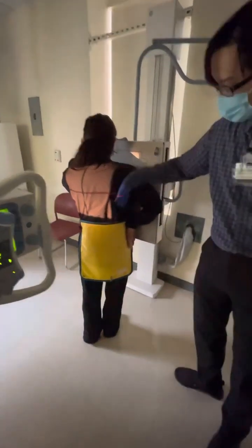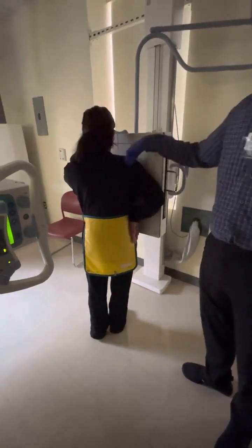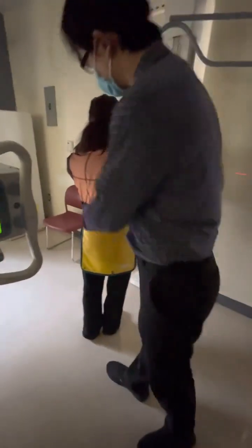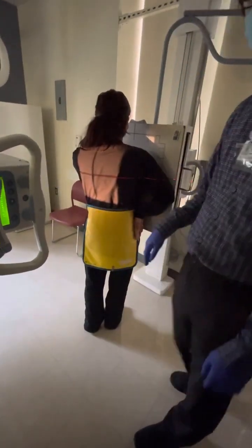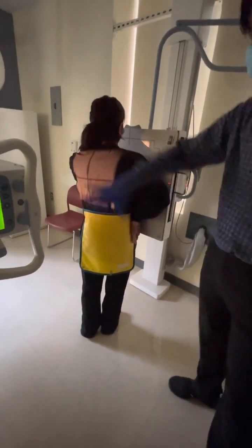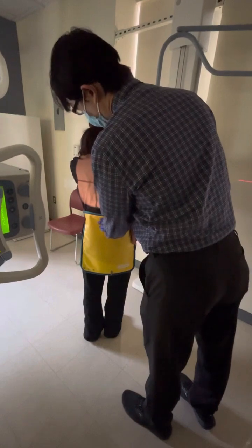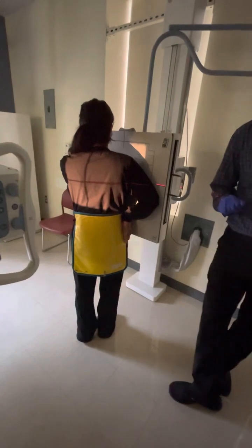Notice, what do I have on the right side now? No light. I have shadow here. So this is focused entirely on the left side, right? I do not have the right side on this picture anymore. So I can even collimate it just slightly. That's the difference between unilateral versus bilateral. Unilateral, only looking at one side of the ribs, and bilateral, we're going to be looking at both sides of the ribs, both left and right side. Make sense?